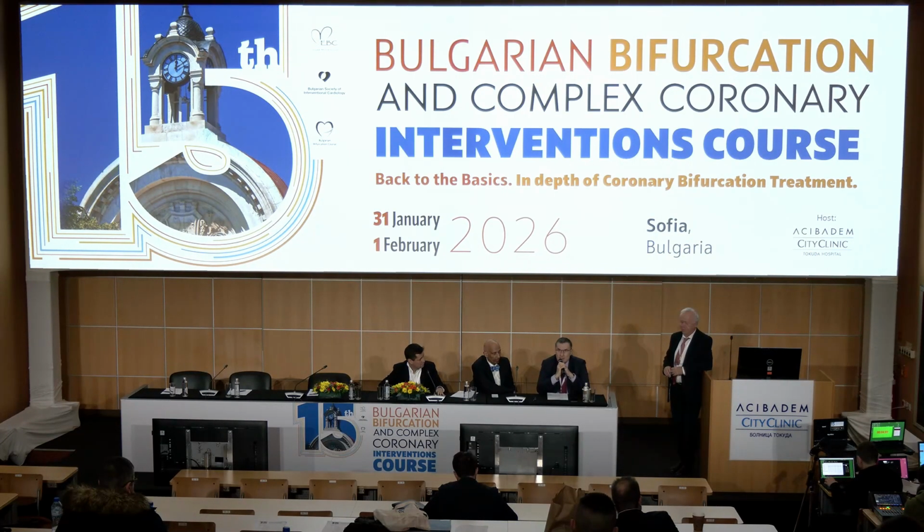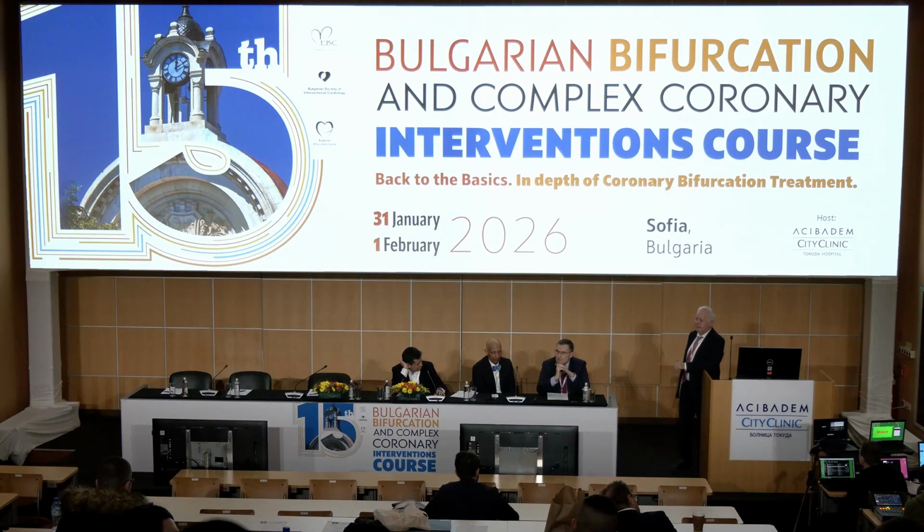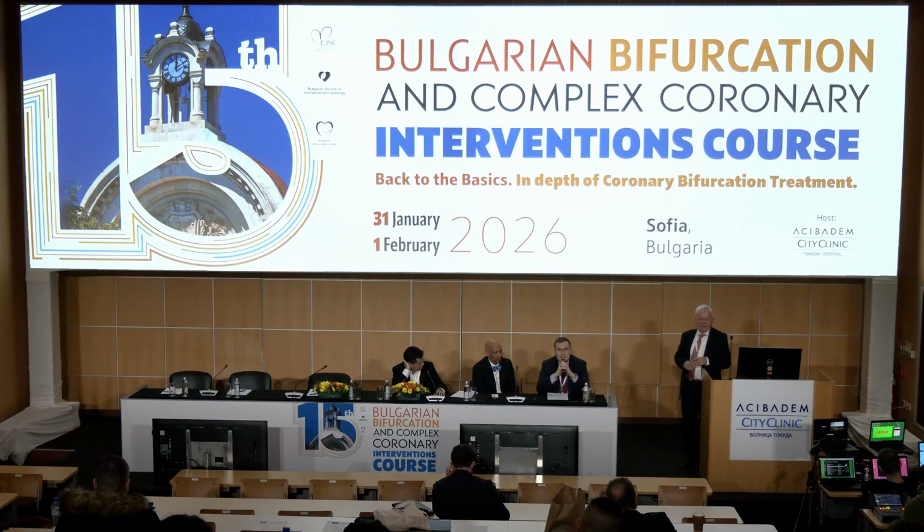The only problem with the OCT, I think, is the contrast use, and maybe the companies should do something to improve this, because 2, 3 or 4 runs mean more and more contrast, and patients with renal dysfunction have a problem with this.